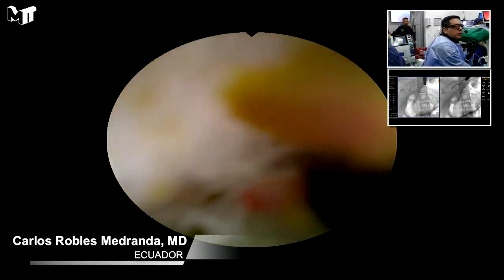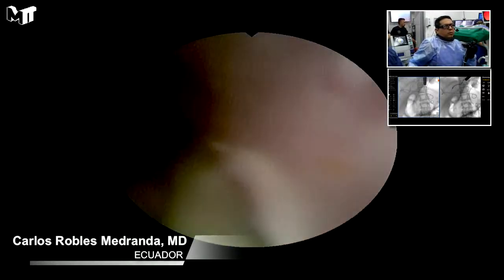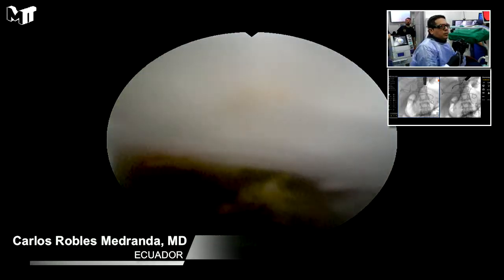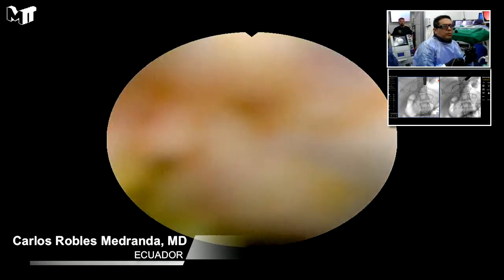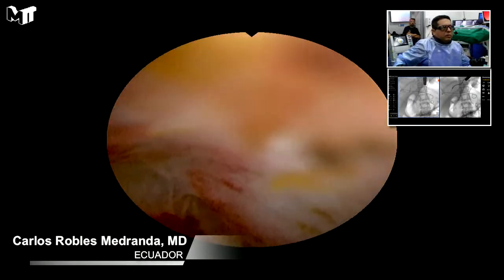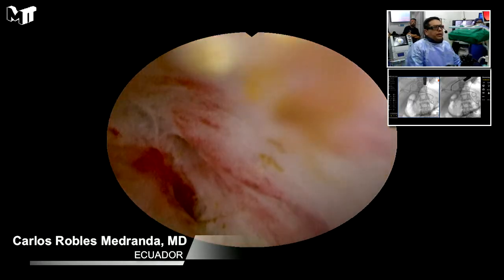Okay, so now ten ahí. So now we are fine. I need to see where is my stent in the right hepatic biliary tract, so it's here.